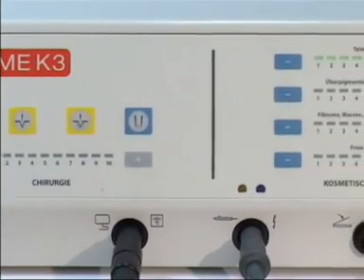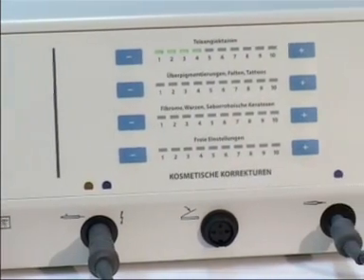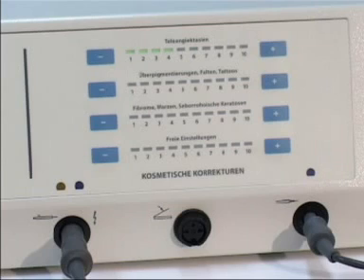In the right part of the front plate are 4 power control panels for cosmetic corrections, which are already pre-adjusted for the various different treatments. Below, in the middle, is the plug for the foot switch. On the right, the plug for the bipolar electrode.